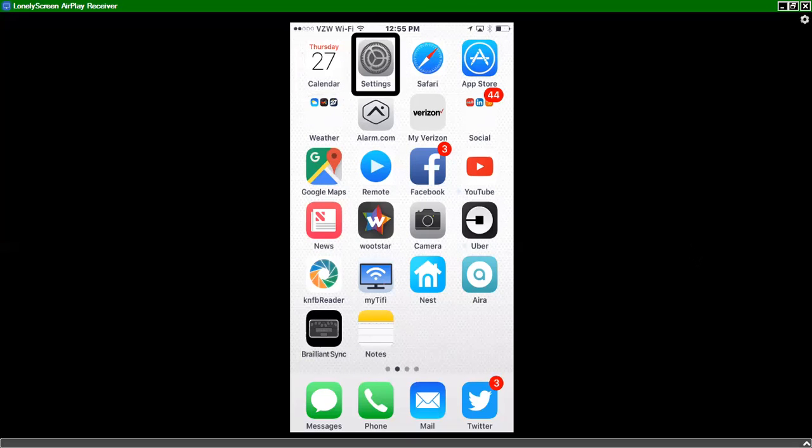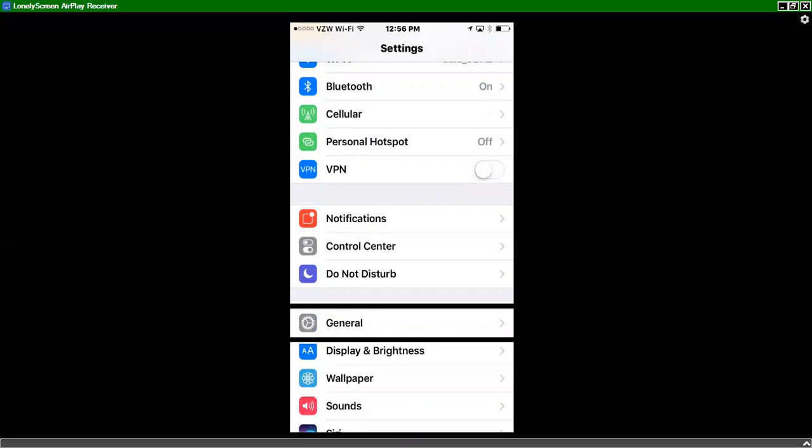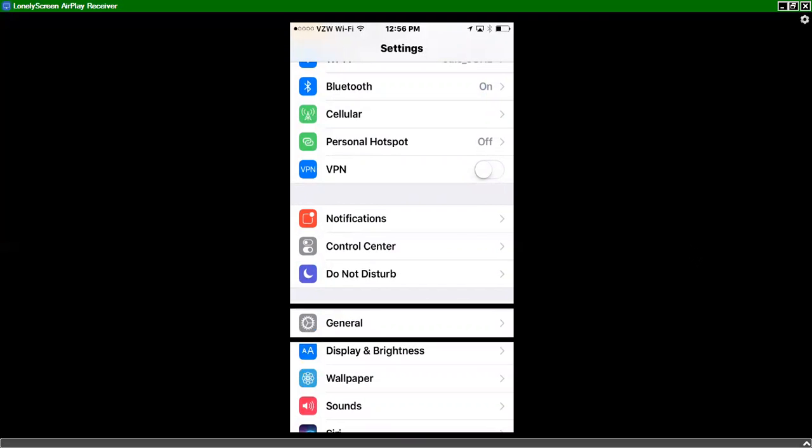Calendar. Settings. I'll double tap. And we'll go down to the general icon. So I'll swipe down. General. Display. General. Button. And double tap.